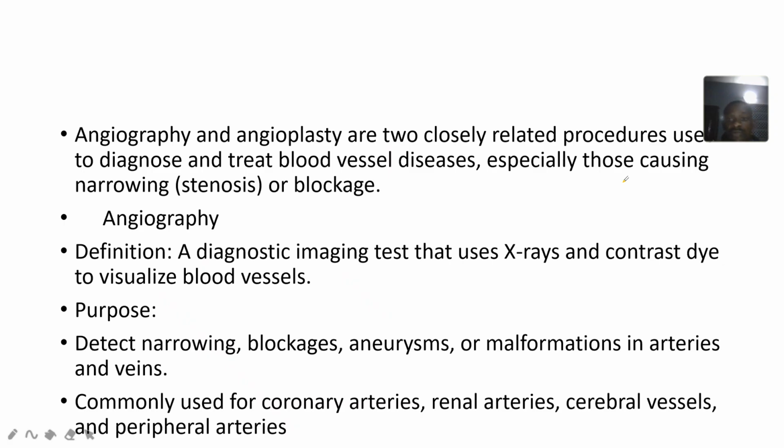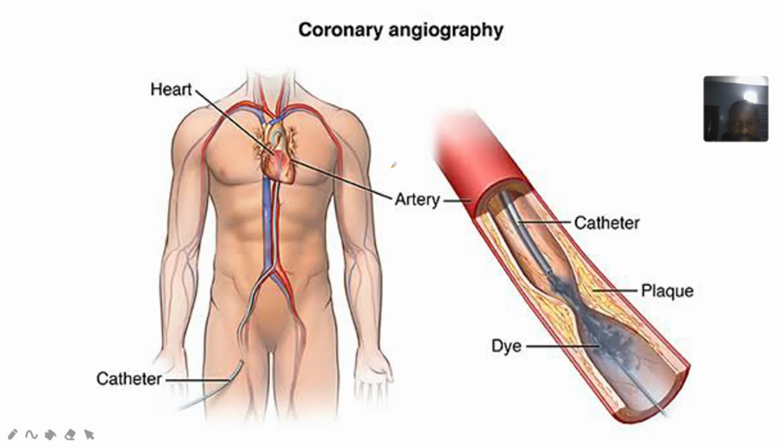They're actually two closely related procedures. They are used to diagnose and also treat blood vessel disease, especially any blood vessel disease that is causing narrowing or blockage in the blood vessel. So you see a buildup of what? Fat, a buildup of fat on the walls of the blood vessel, reducing the space in which the blood should pass.